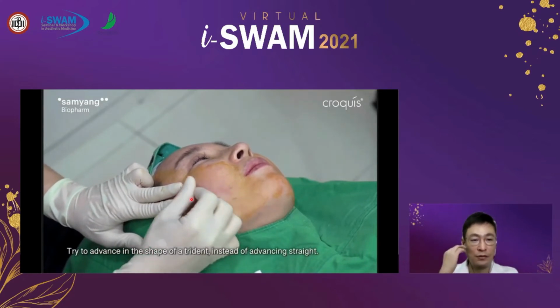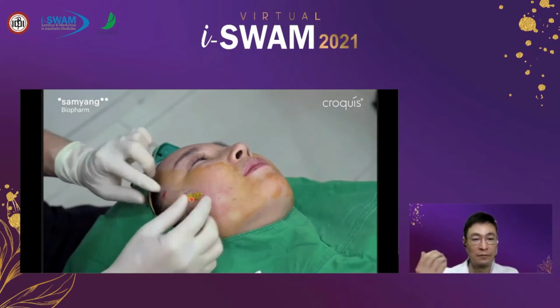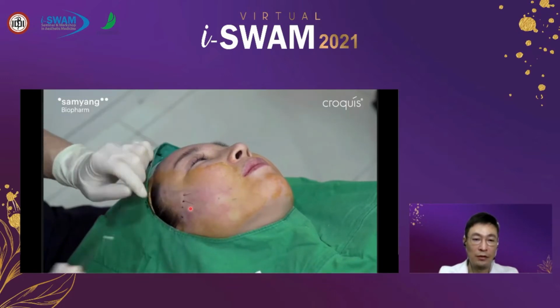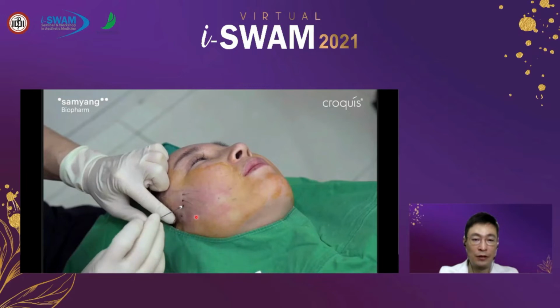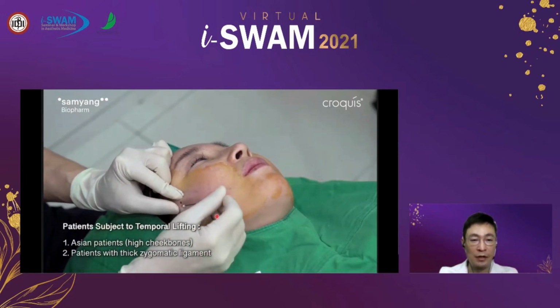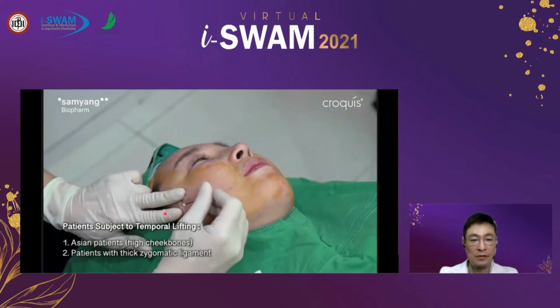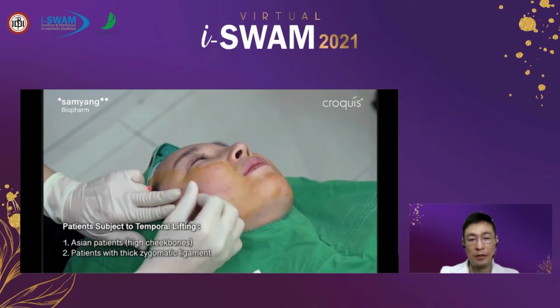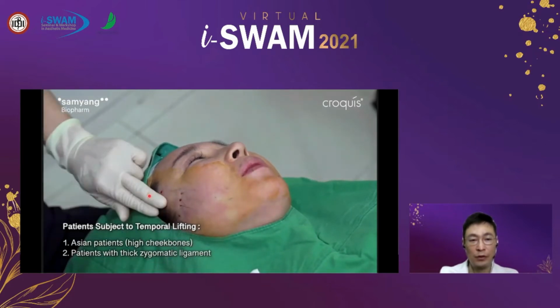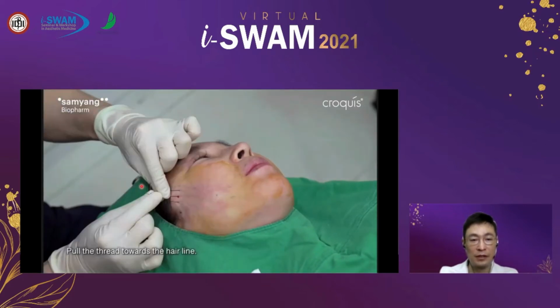Then I can use an alternative treatment method. For this area, I do not tie, because you don't need to tie, because there may be some strong fixing points in the temporal fascia.